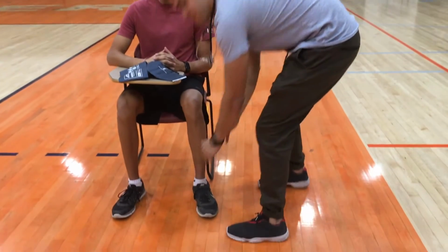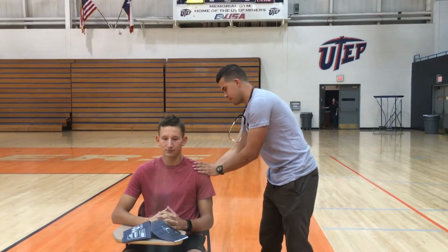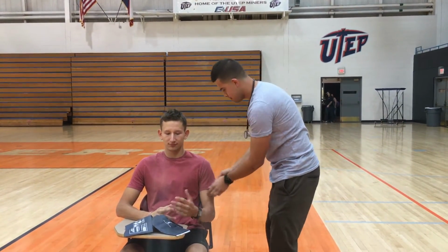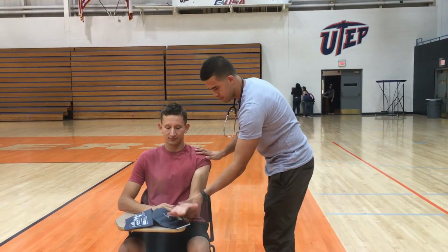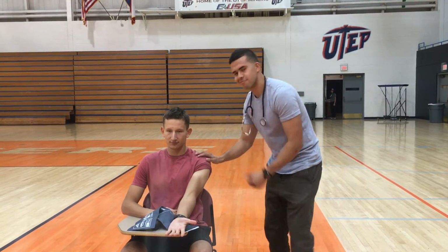The client should have both feet flat on the floor and sitting straight up with their back supported by the back of the chair. We lift the sleeve out of the way and make sure the arm is straight and not bent, with the palm facing up and resting on a surface around heart level.